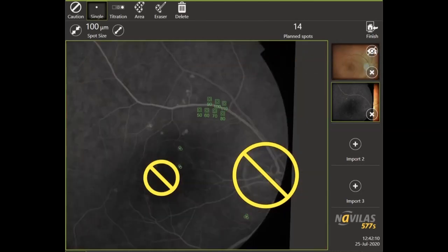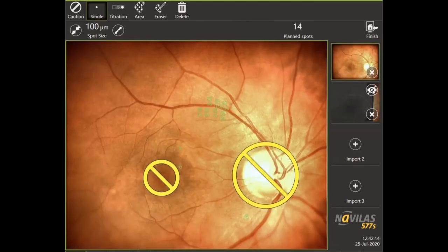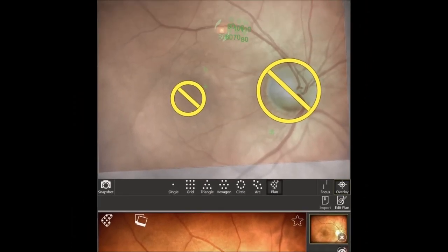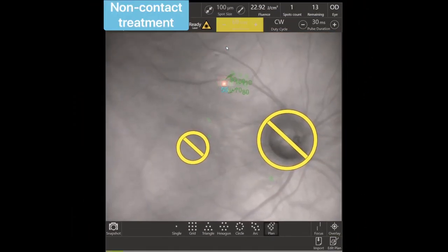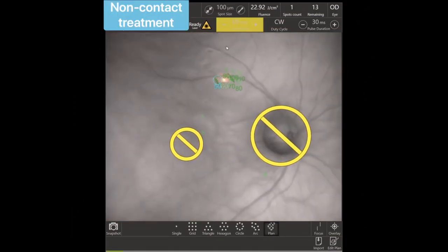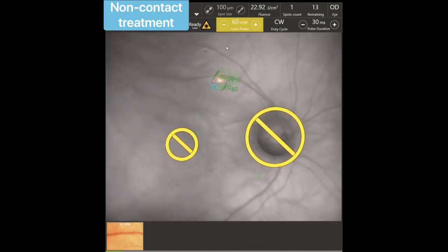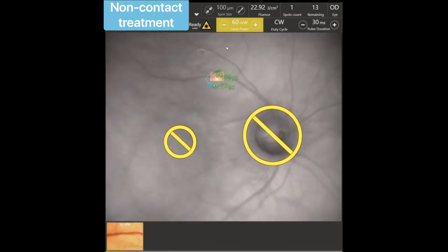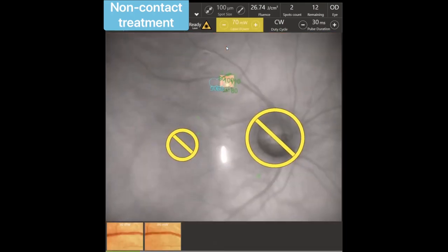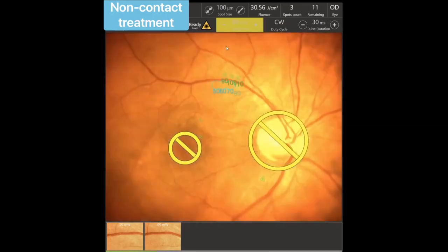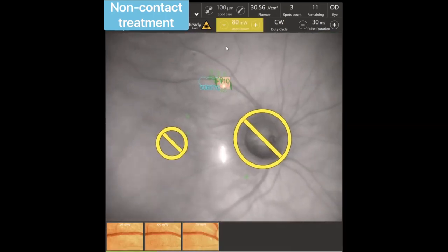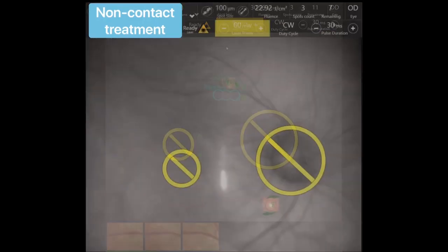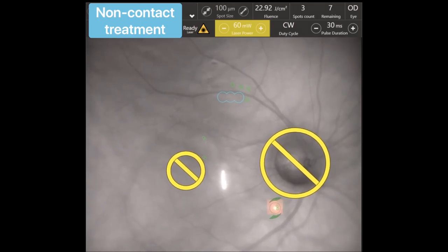We used epibulbar anesthesia eye drops of oxybuprocaine in both eyes before treatment. Then we proceeded to the treatment mode in infrared illumination, which is extremely comfortable for the patient. After applying three test burns, we revealed coagulates of first and second degree.